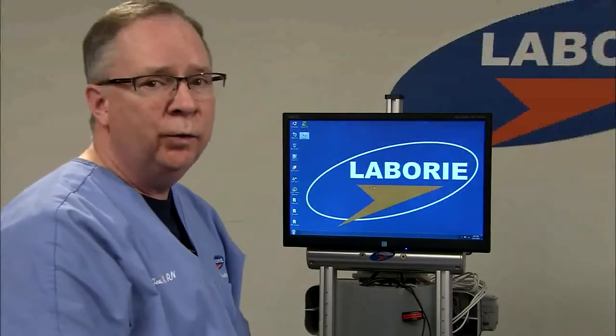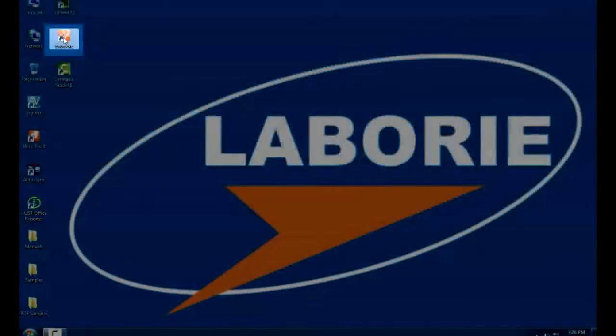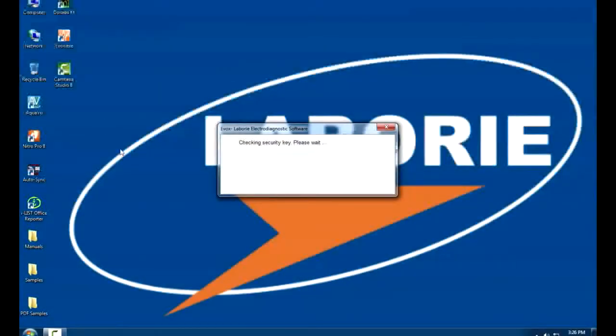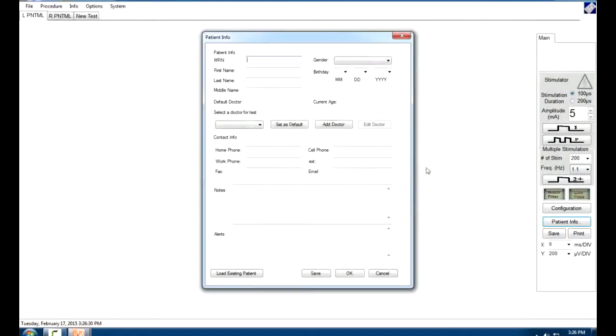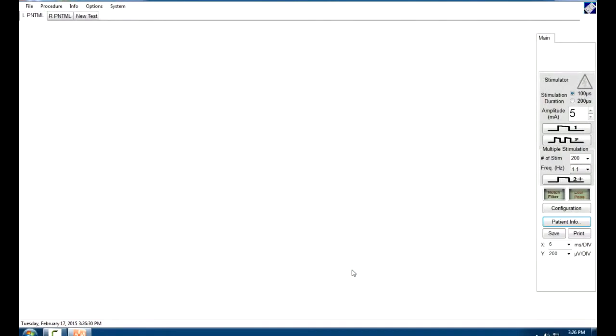Let's go ahead and get the software ready for data acquisition. Double-click the EVOX icon. It'll go through its security checks. Enter patient information. You will be required to enter the medical record number, a patient first and last name, gender, and birth date. Click OK.